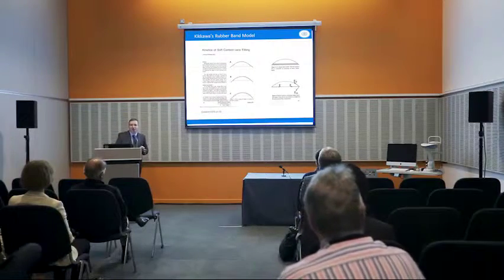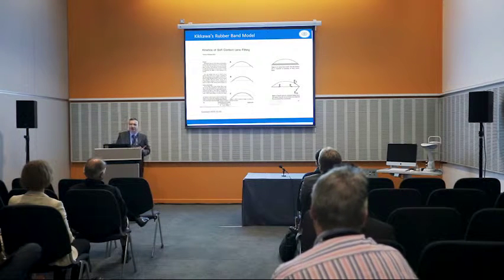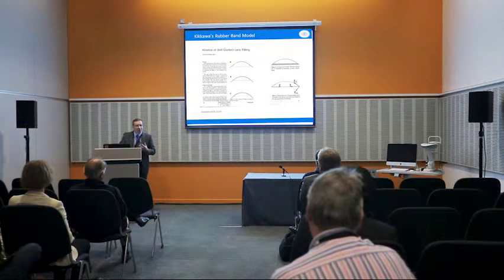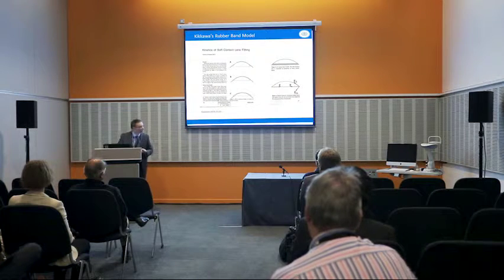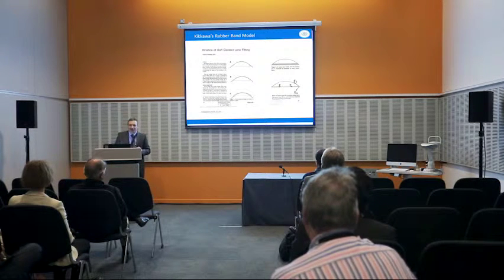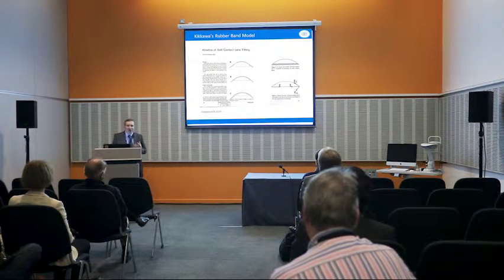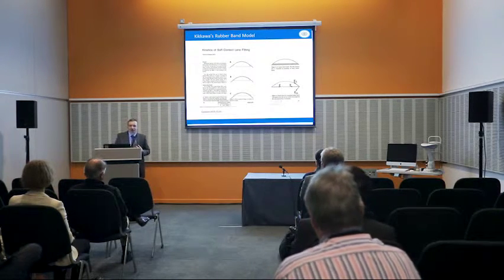Now, why is this important? Perhaps we've been led to believe that soft contact lens fitting in this country has become a bit of a dead art. Well, I would really challenge that notion. Some people say that soft contact lens fitting has become a process of actual lens selection, taking one fit lens off the shelf. But in reality, it's much more complicated than that. And whilst many soft contact lenses will fit something like 70 to 80% of our population, there's certainly 20% of patients where it will not fit.